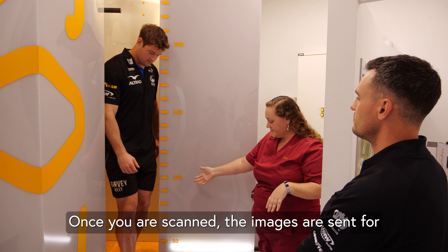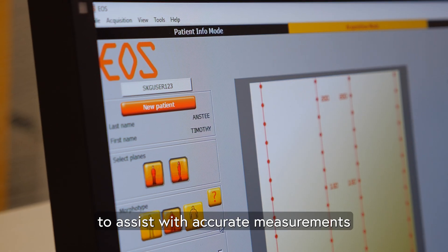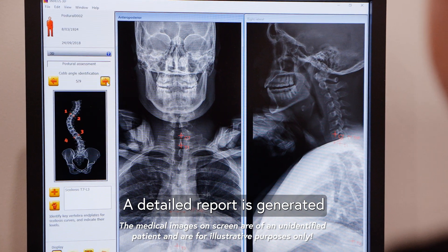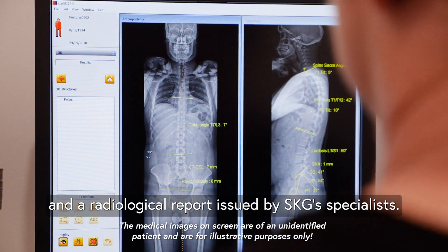Once you are scanned, the images are sent for software analysis plotting points on anatomy to assist with accurate measurements and compared to reference data. A detailed report is generated and a radiological report is issued by SKG's specialists.